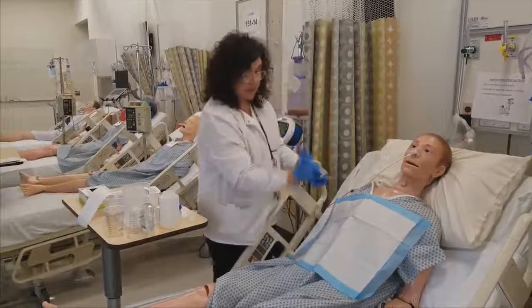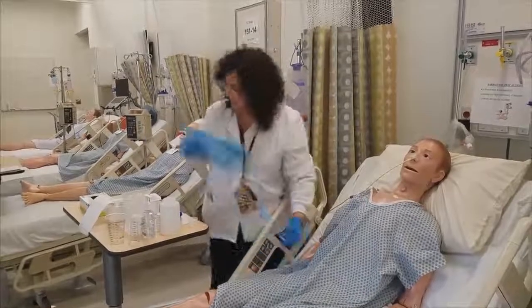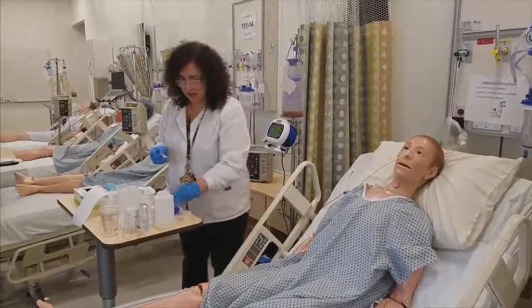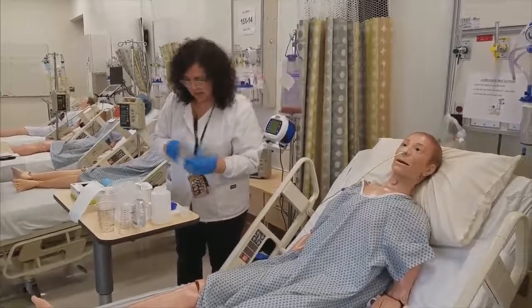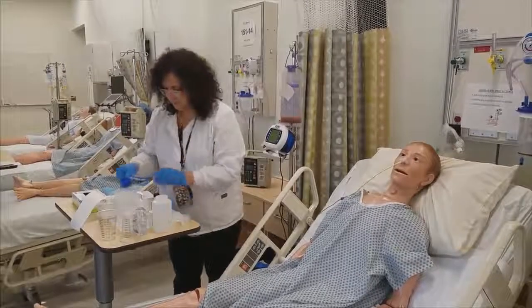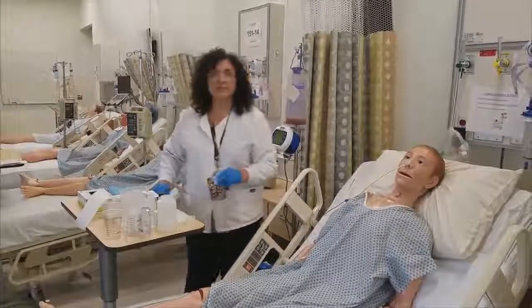Make sure that the head of the bed is at least 45 degrees, which it is, and then clean up. Put my patient in a position of comfort and safety. I could also clean out this pill crusher and have it ready for the next time we need it. So this concludes my demonstration.